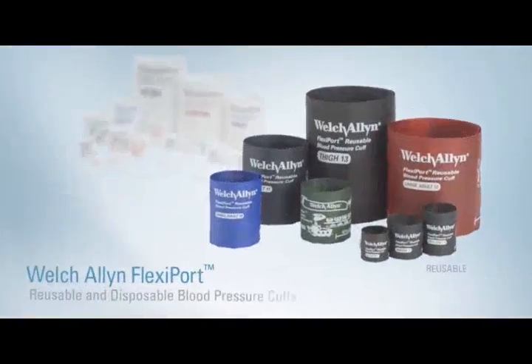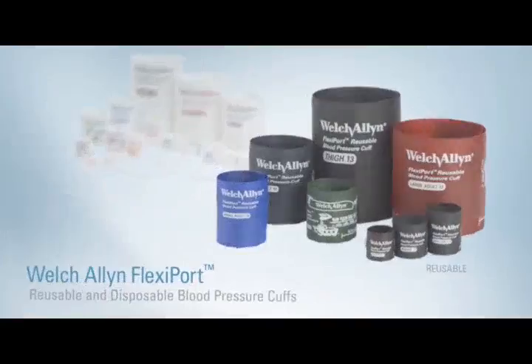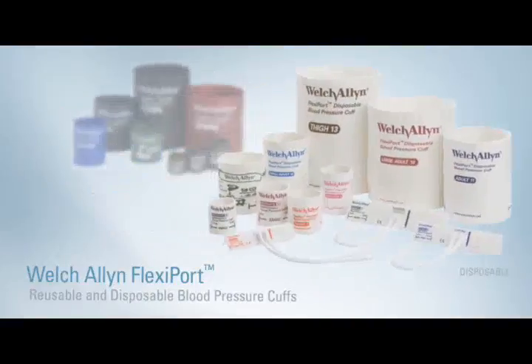Simple to find, easy to use — Welch Allyn FlexiPort cuffs. True standardization in a snap.